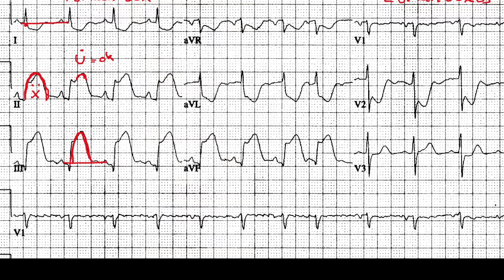In AVL, drawing a line shows ST depressions, no Q waves, no peak T waves, and T wave inversions. Moving to AVF, we also see ST elevations — no Q waves, no T wave inversions, and no peak T waves. Then moving to the precordial leads: in V1 we don't really see any ischemic changes for the most part.